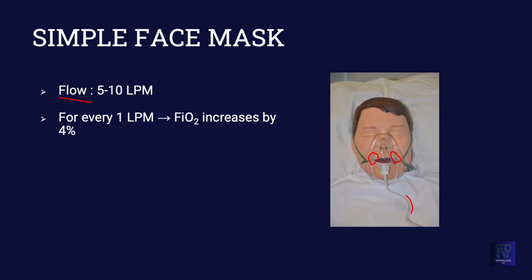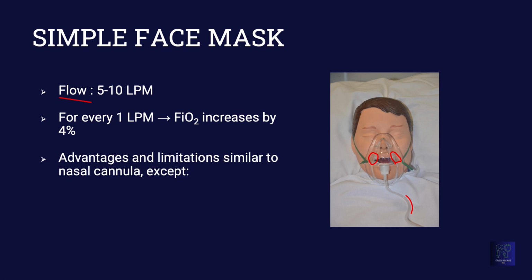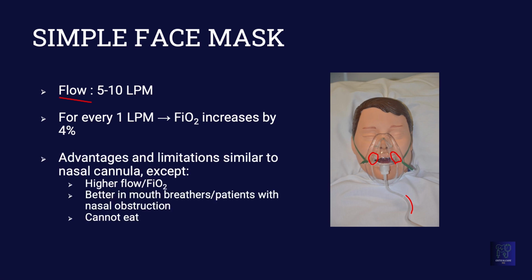Again, with every 1 liter raise in the flow, FiO2 at the level of alveolus is expected to increase by 4%, but this number changes wildly depending on patient's respiratory drive. Compared to nasal cannula, a face mask has the following strengths and limitations.